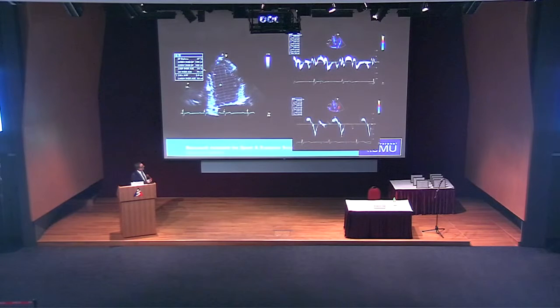One thing also that was very interesting was that the time period from the end of diastole to the start here was prolonged. So it was taking longer to actually get the ventricle to start. This is the isovolumic contraction time.